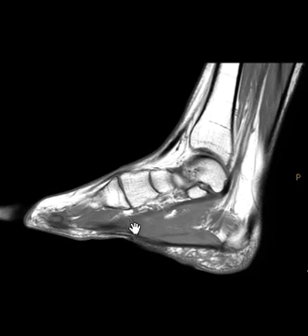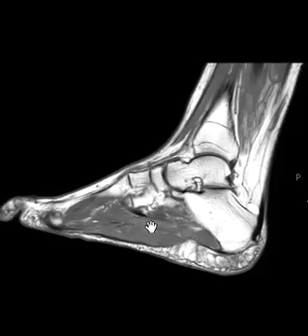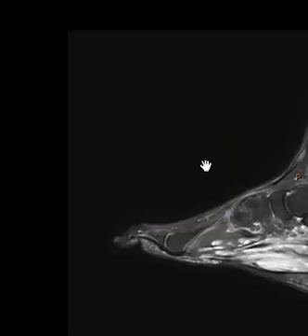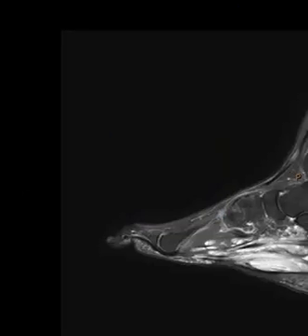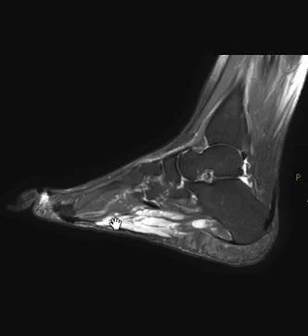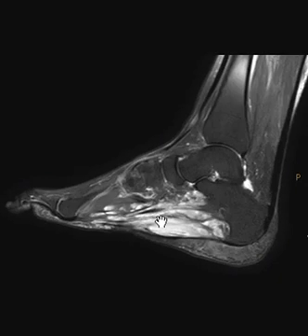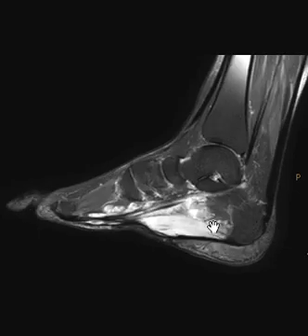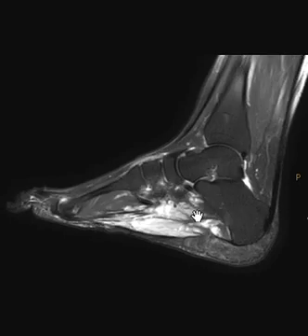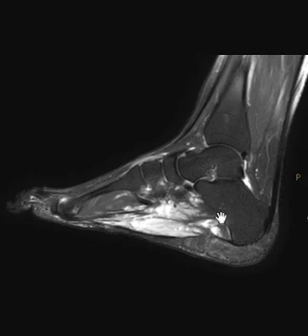There is some fullness that blends right with the muscles — it looks like the muscles are prominent. But if we put up a T2 fat-suppressed sequence, we can see that it is really not the muscles; it is an infiltrative process surrounding the plantar fascia, or deep to the plantar fascia, surrounding the flexor tendons here.